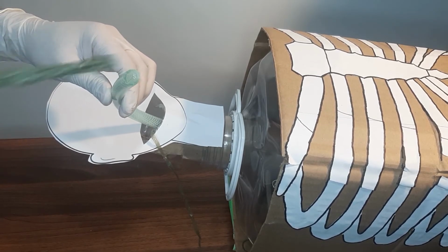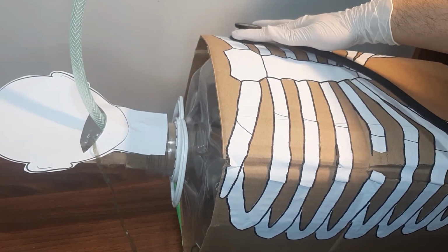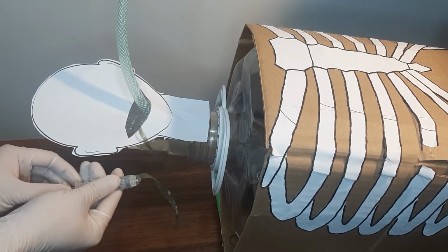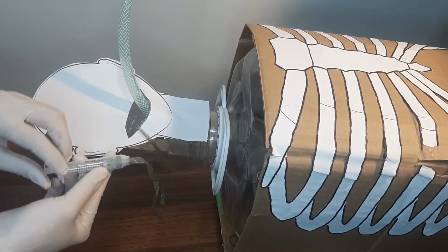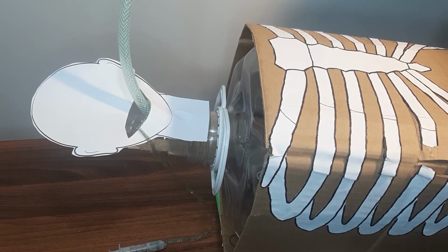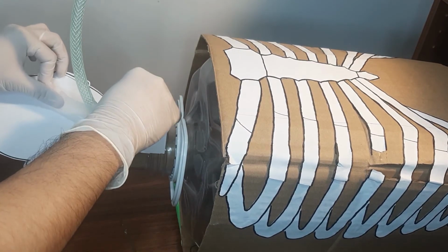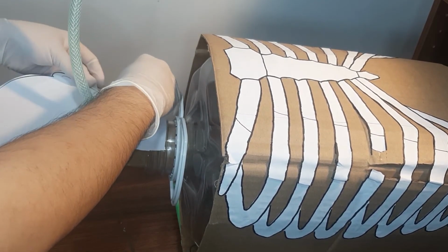Check for chest expansion. Check the position of the cuff by auscultating along the chest. There should be equal breath sounds in both lungs and no gurgling sounds. If one side is louder, deflate the cuff, withdraw the tube centimeter by centimeter, then auscultate again. Once correct positioning of the tube is confirmed, plaster and secure the tube using tape and remove cricoid pressure.